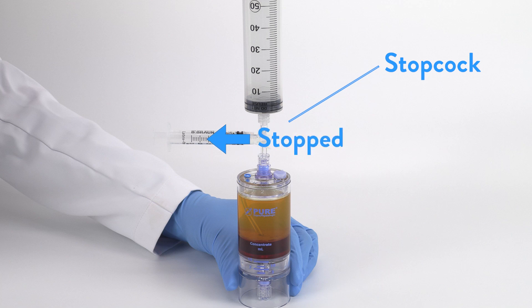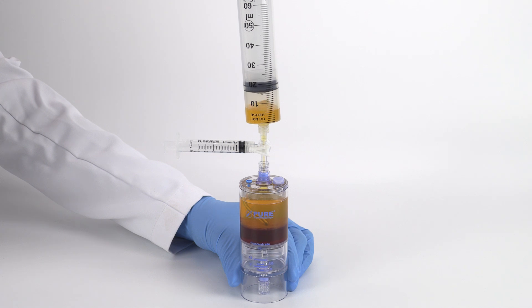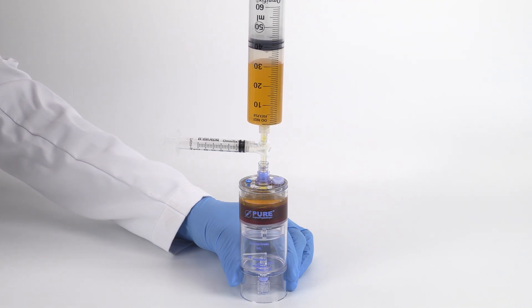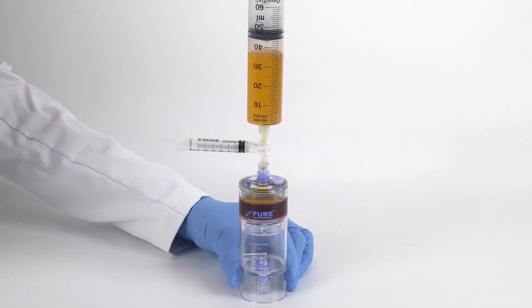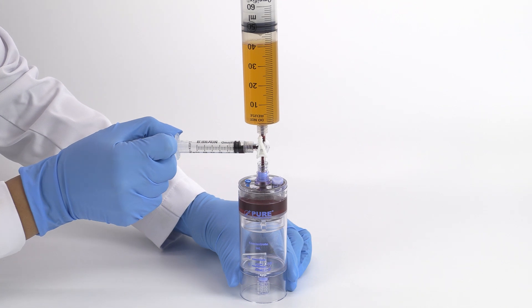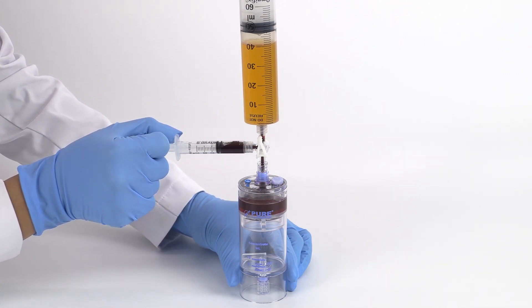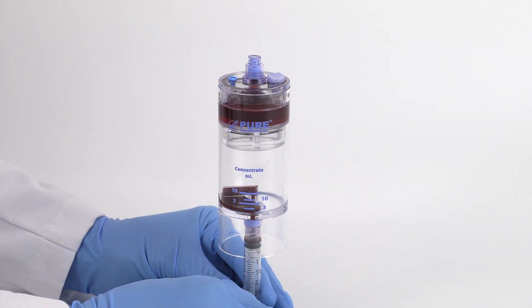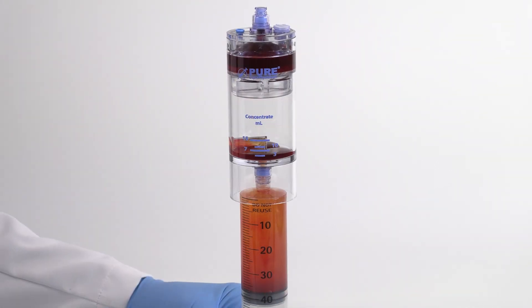After centrifugation, attach the sterile syringe accessory to the needleless port and aspirate the bone marrow plasma suspension. Then open the stopcock to the three milliliter syringe and aspirate two milliliters of red blood cells. Transfer the aspirated solution into the concentrator device as shown — inject the bone marrow red blood cells first, then the bone marrow plasma suspension.